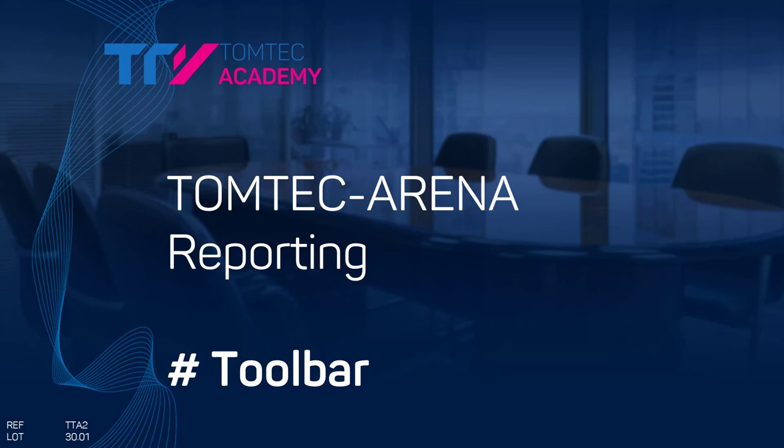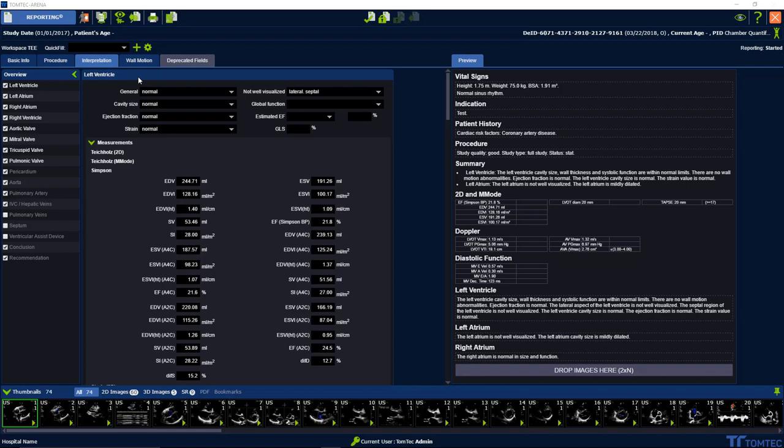How to use the toolbar on TOMTEC reporting? Let's start on the left side. You can see we have a description for every icon.